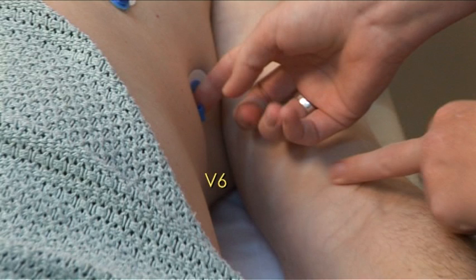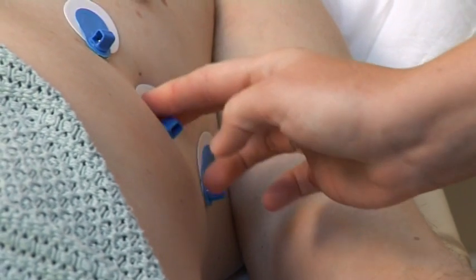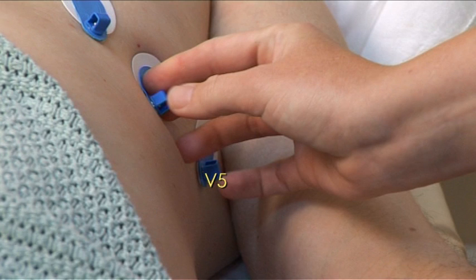V6, mid-axillary line in the same horizontal plane as V4, again next to V5 but still further over in line with the armpit. V5, anterior axillary line in the same horizontal plane as V4, next to V4 but further over in line with the armpit.